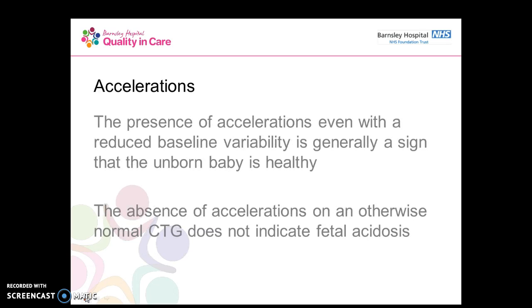I'm just going to talk a little bit about accelerations, which sometimes can be a little bit confusing when you're looking at them and how to classify them. But I think basically what you've got to remember is that if the baby's heart rate is accelerating, then the baby is responding to stimuli, and so that's a healthy sign.